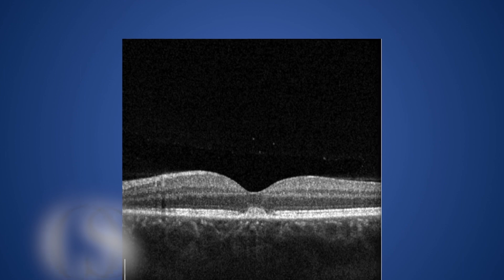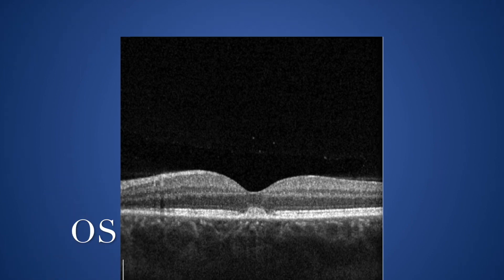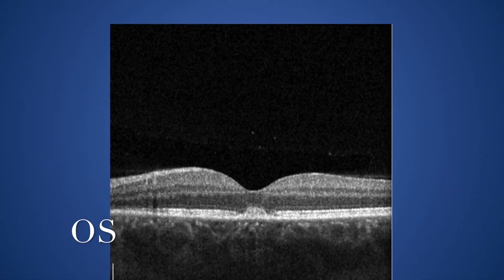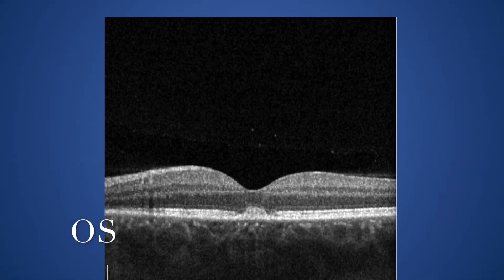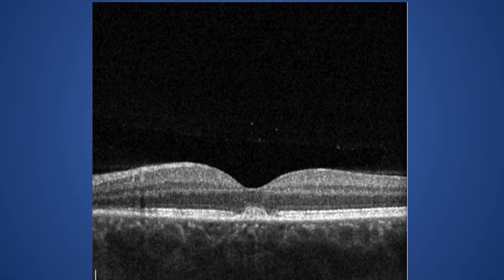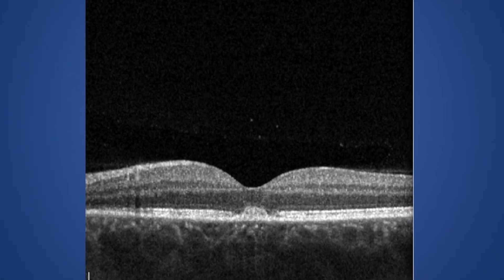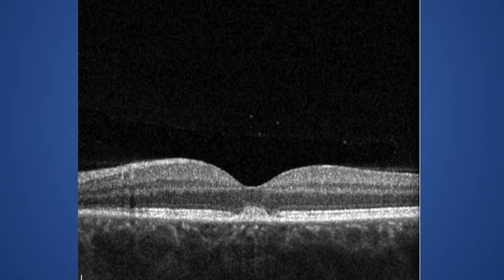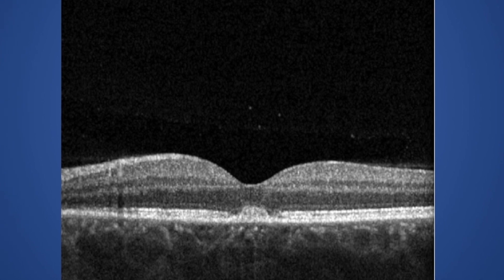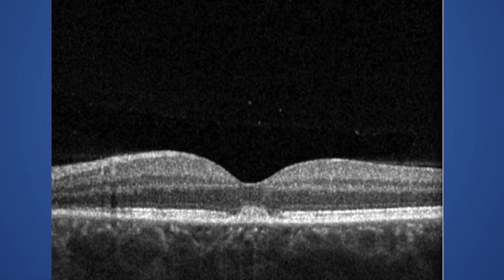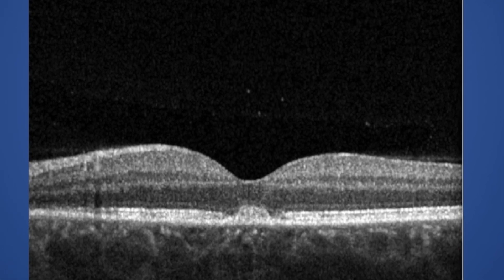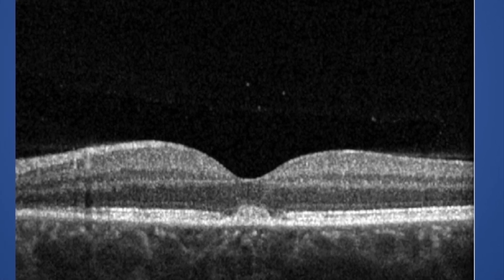OCT examination of the left eye shows a disruption of the outer retinal bands, as well as thickening of these layers. The pathology is mainly involving the inner side of the retinal pigment epithelium, as well as the photoreceptor layers, with some involvement of the external limiting membrane.